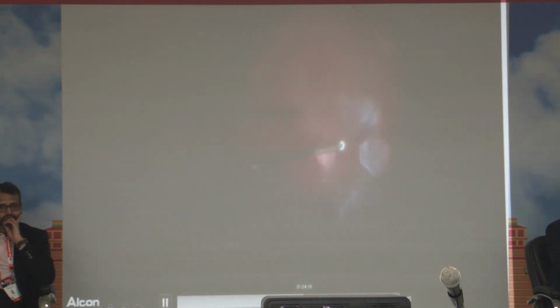And what is delamination? When you cut across the pillar which is attached to the bridge, that is the delamination. So here I'm showcasing the segmentation with the help of the cutter, and once we segment it, you can do multiple piece segmentations and then you can do the delamination. This whole surgery was done with the cutter itself. As you can see, I have never used a forceps in any of these. Thanks to these 10K cutters with a slightly beveled end, it acts like a forceps also, and definitely with a good cut rate and cut speed, with controlled handling.